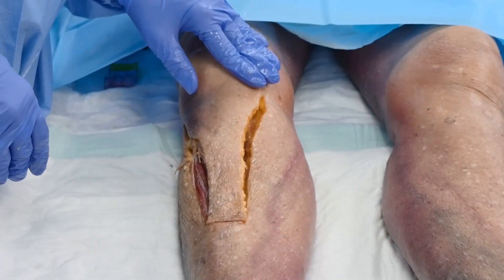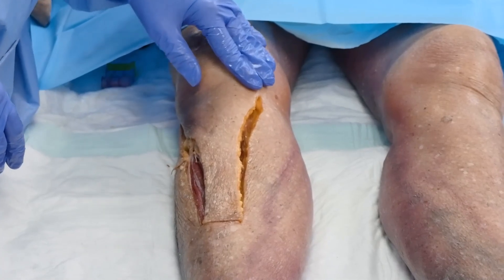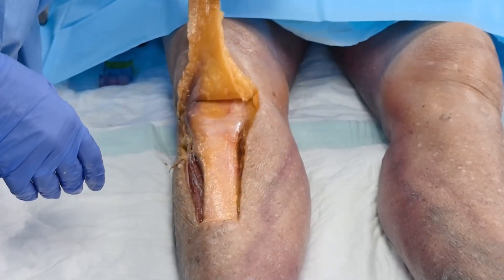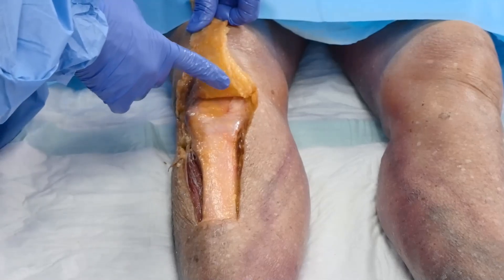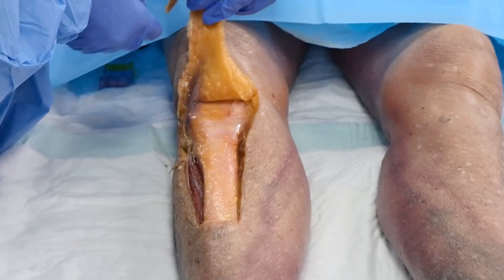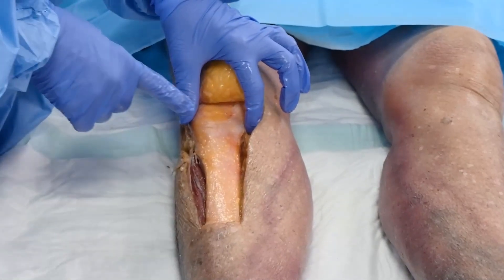Let's review anatomy for the tibia. We want to insert into the proximal and distal ends of long bones. You can see I'm going to deflect back this tissue — there's a nice piece of fat pad there. We'll talk about needle selection in a minute, as that'll come into play.